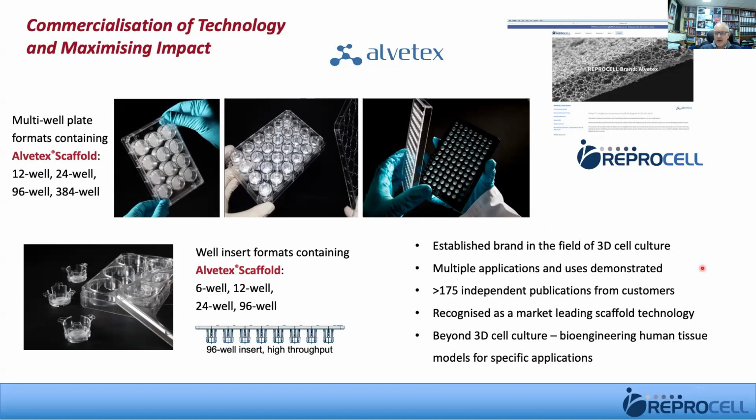It is an established brand in the field, and it's probably now recognized as the market leader in scaffold technology for 3D cell culture as a form of physical scaffold support. But whilst it's used heavily for the concept of 3D culture itself, more recently we've been using it to bioengineer human tissue models, so to increase the complexity of our 3D systems.